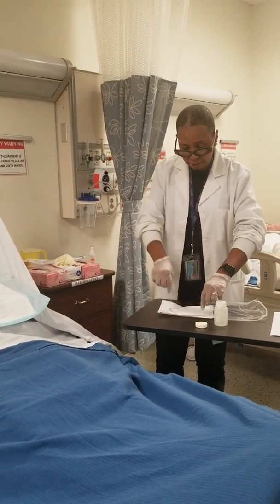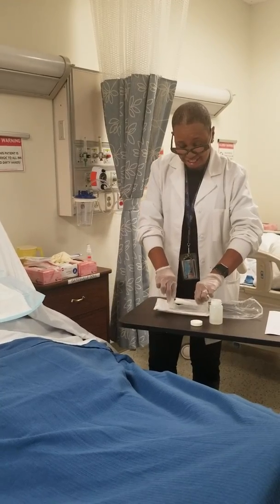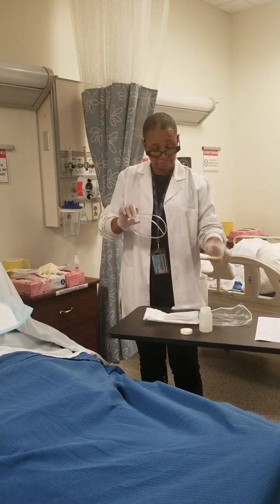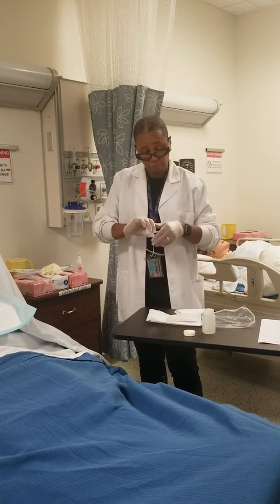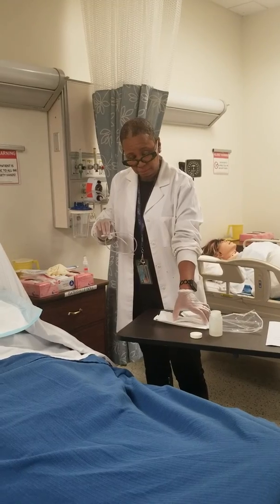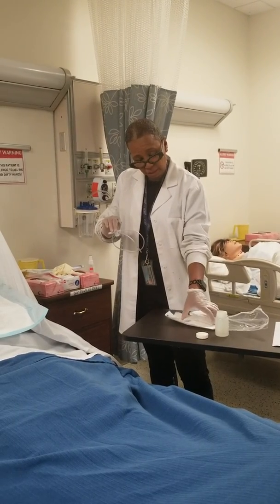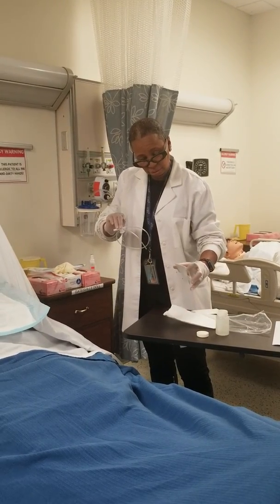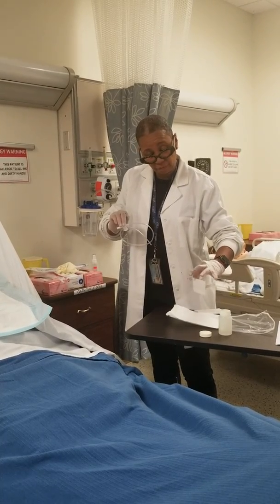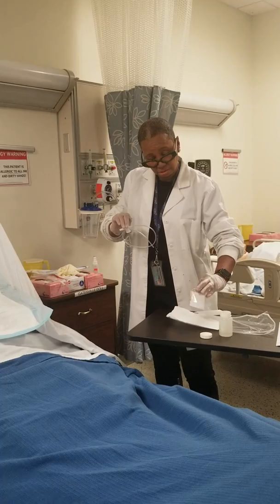Okay, so this is all still sterile, right? Yes, ma'am. Okay, so I can open this up. Let me drop that there. What else would I need to do? Unfold your cup. Unfold my cup. Is it all still sterile? Yes, ma'am. I probably should have gone about it a different way, but it is what it is.